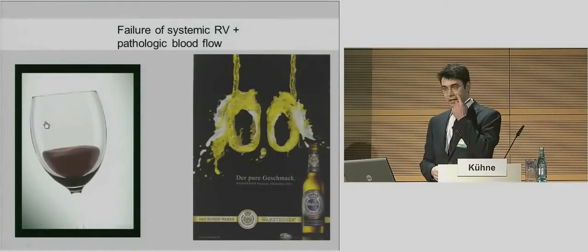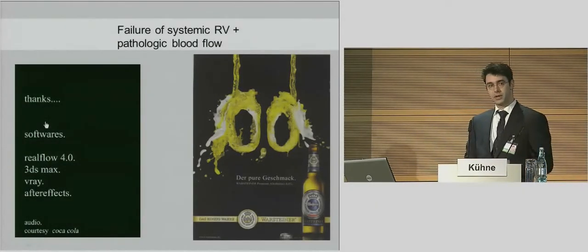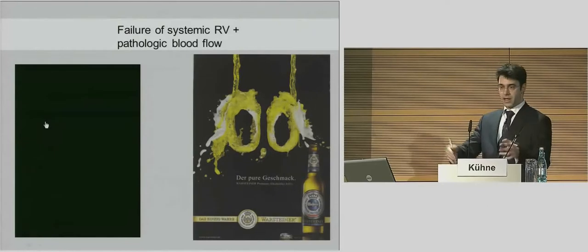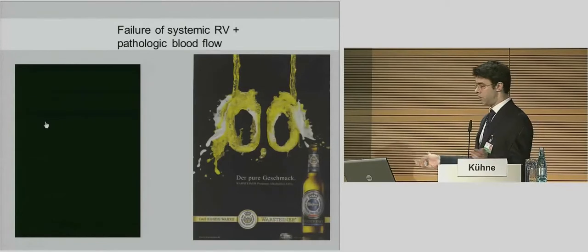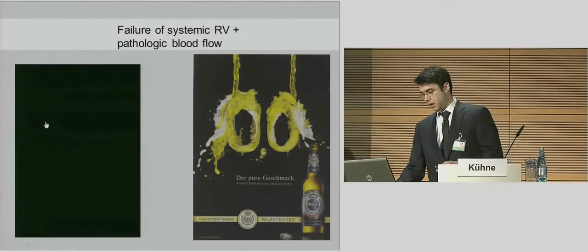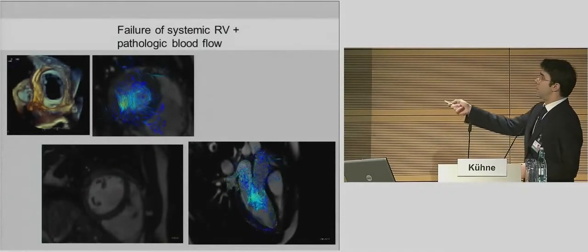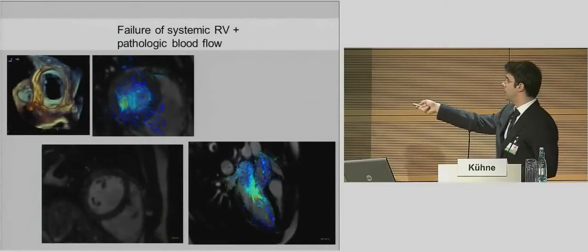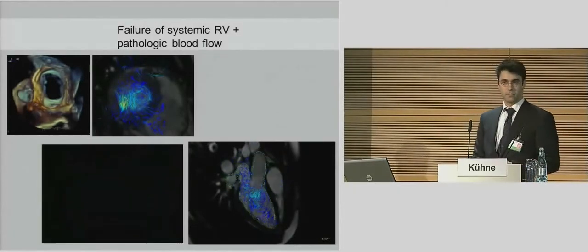And this is a pretty easy way to visualize how the blood kinetics in the ventricle must work, because we do not only want the blood to go from the left atrium and somehow fill the ventricle. No, we want the blood to come from the left atrium or right atrium into the ventricle and not lose its kinetic energy. And if you look at the patient now, it looks like that. So passing from the AV valve, we can clearly see these kinetic moments. The blood goes in and is then going out, like filling a glass of beer or wine.